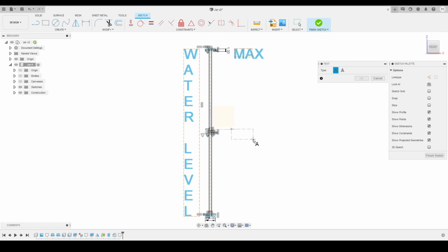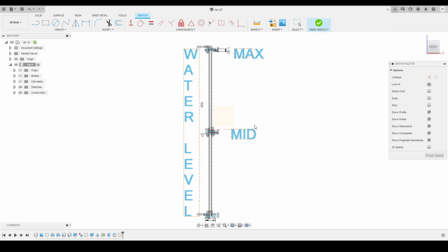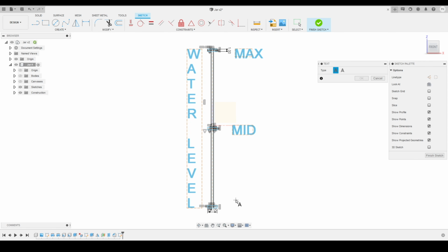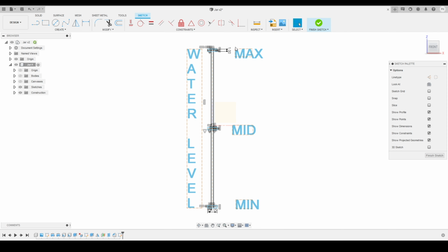to make as a mid, so I will just write mid, and then at the bottom I will repeat the same process. We'll activate the text tool on the bottom, and we'll write text over here with the letters min, and press OK. So you can see these are the three texts we had created, and we'll make sure that all the three texts are on the same level, vertical orientation.